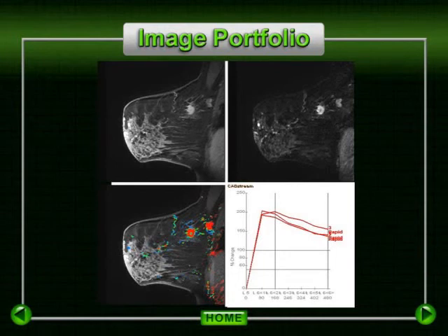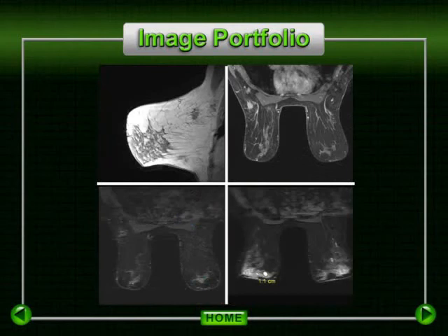If, however, there is pathology, we will then go back and begin filming individual slices which evaluate the pathology. In general, we always provide images from the dynamic acquisition showing the raw data, the subtracted data, and subsequently the raw data with color parametric mapping applied. We then include the enhancement kinetic curves. When applicable, we will also film additional images, such as serial images of the STIR acquisition in cases of extensive cystic changes of the breast, or when there are other findings on the unenhanced sequences that are of benefit to the case.